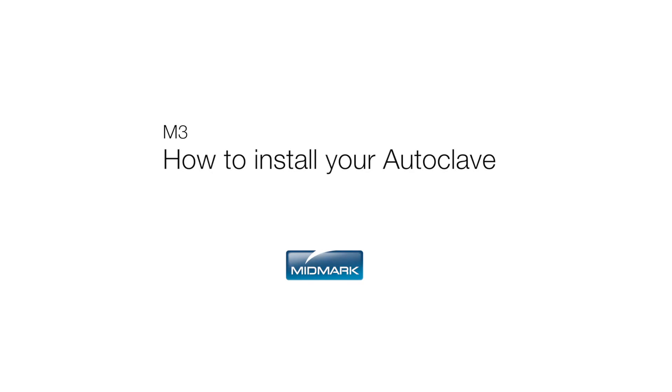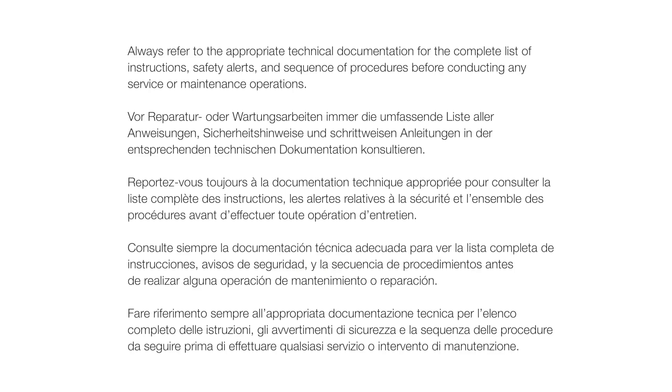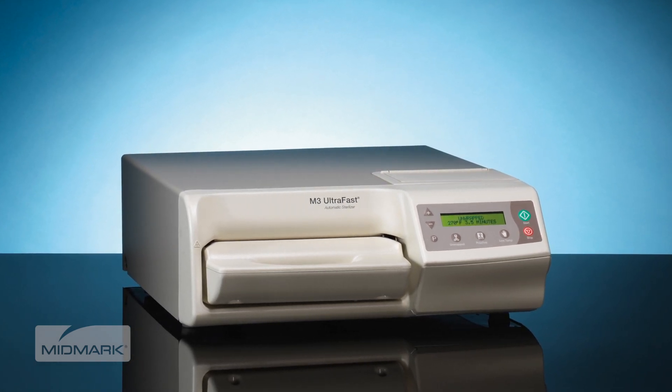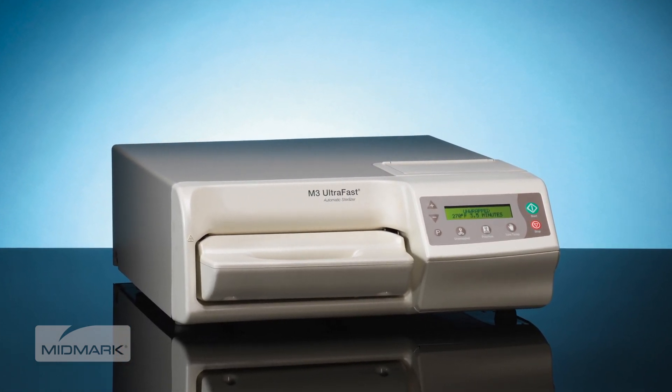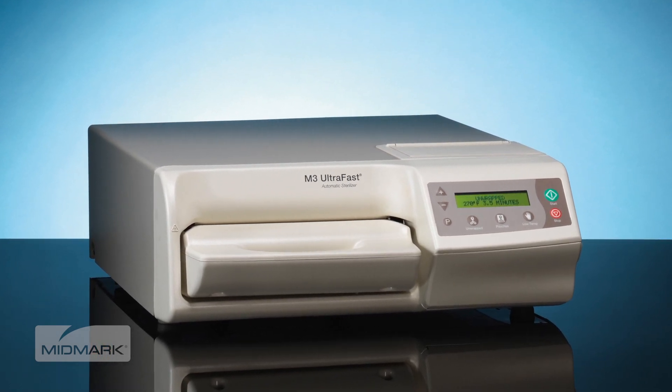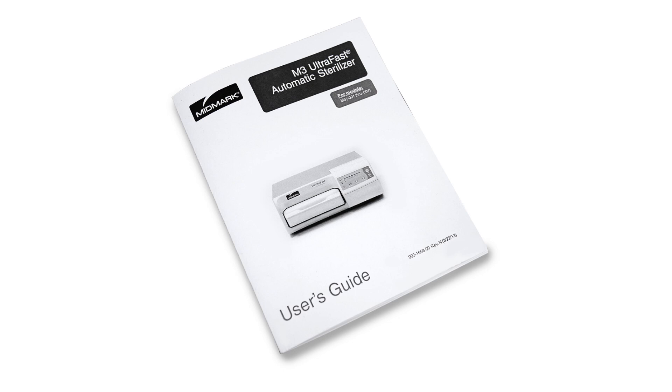This video is an overview of how to install your M3 Ultrafast. Always refer to the appropriate technical documentation for the complete list of instructions, safety alerts, and sequence of procedures before conducting any service or maintenance operations. The primary concern of Midmark is that equipment is operated and maintained with the safety of the patient and staff in mind. To help assure safe and reliable operation, please be sure to read and understand the M3 Ultrafast User's Guide before attempting to install or operate the sterilizer. Ensure that the appropriate personnel are informed on the contents of the manual.